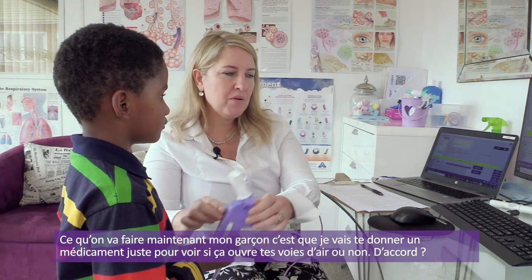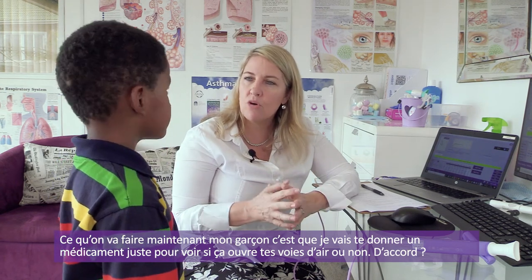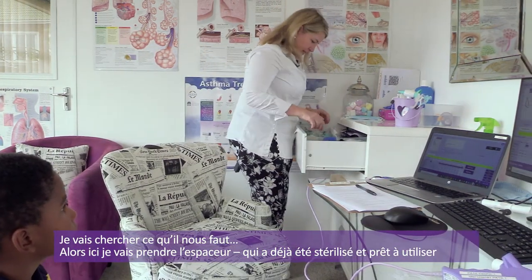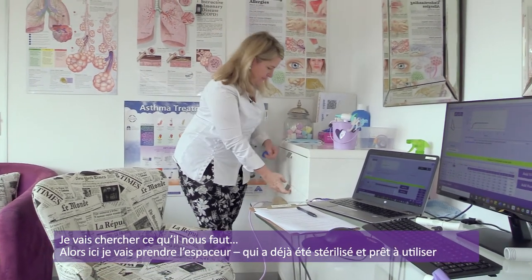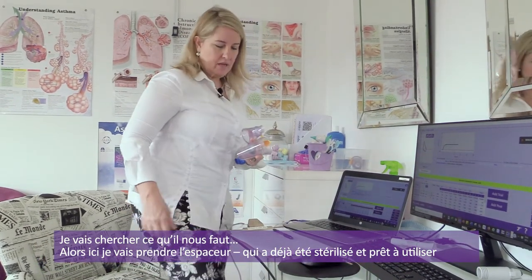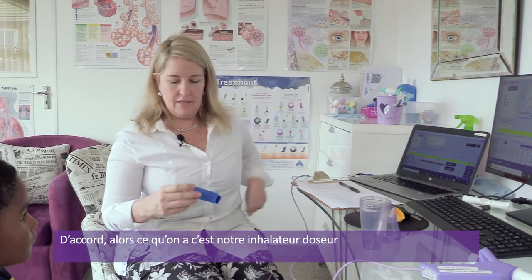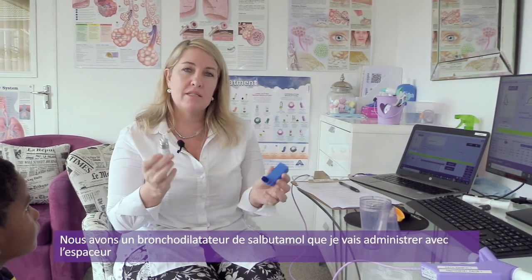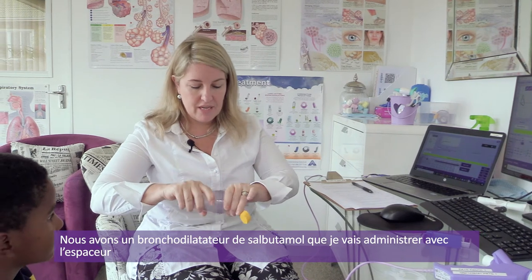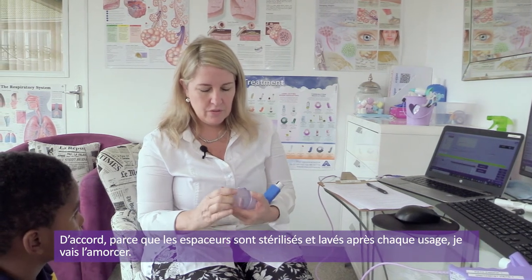Thank you. So now what we're going to do, my boy, is I'm going to give you some medication just to see if it opens up your airways or not, okay? All right, you can take a seat. And let me get what we need. So here I'm going to get our spacer device. These spacer devices have been sterilized. And they're all ready for use. Okay, so what we've got here is our metered-dose inhaler. We've got a salbutamol bronchodilator, which I'm going to administer through a spacer device. All right, so because they've been sterilized and washed every time, what I'm going to do is just prime it.